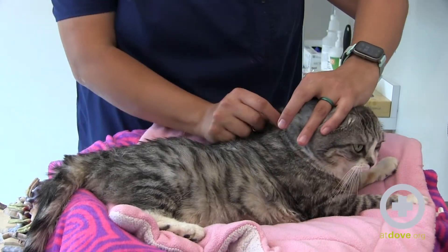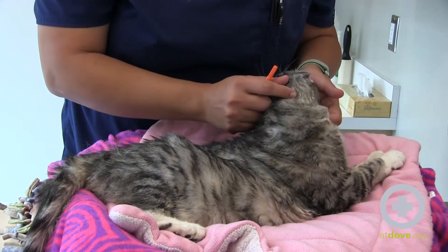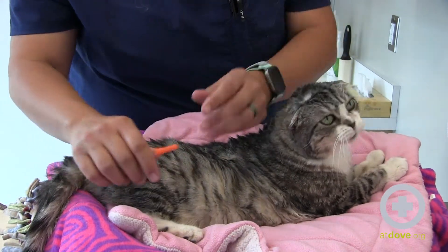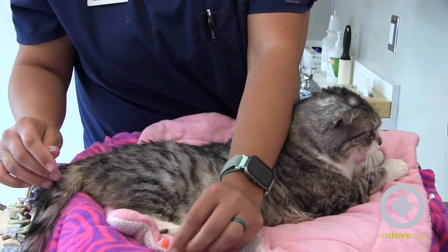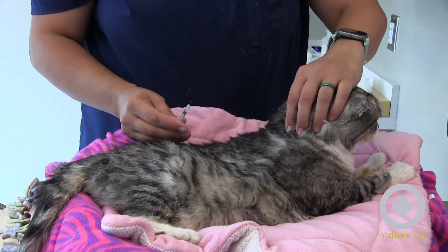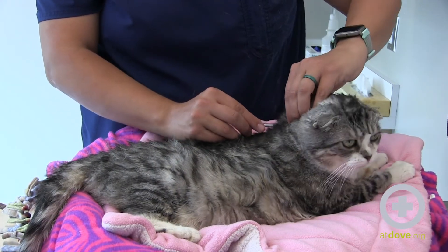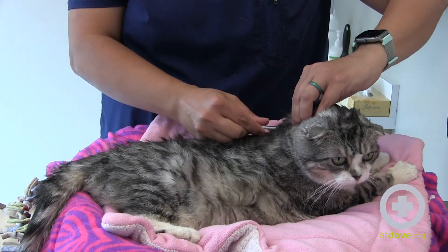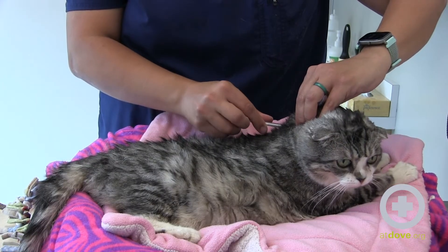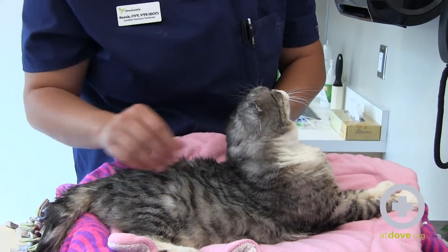I'm pinching her skin and I have skin between my fingers. I'm going to take the cap off and set it down somewhere where I can remember where it is. I'm going to tent this skin and inject in — I feel the needle go through. I'm going to pull the plunger back, make sure I don't have any blood, and then I've ejected it and I just rub where she got the injection.